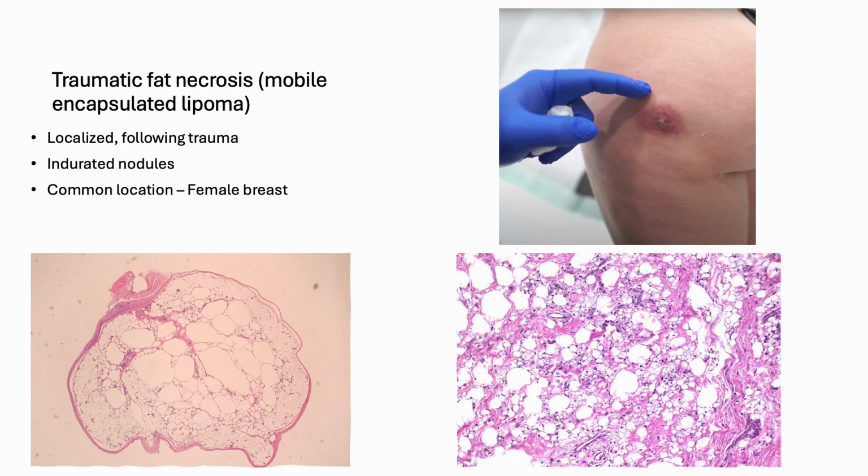Last but not least, there is a type of disorder commonly seen, but it can be a mimicker for panniculitis. It is traumatic fat necrosis. As the picture shown here, you can see this area maybe had some trauma before, and in the tissue, we are very familiar with fat necrosis, with large and small lobules with histiocytes. But if they only give you one portion without the clinical history, you may confuse this with panniculitis. So the history of trauma is the key.